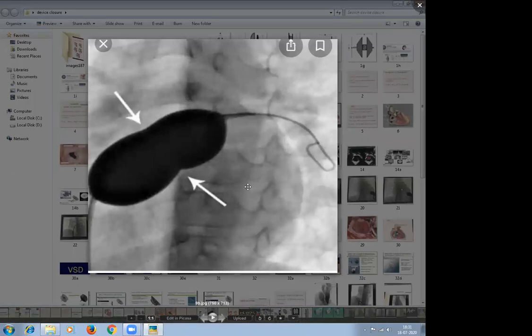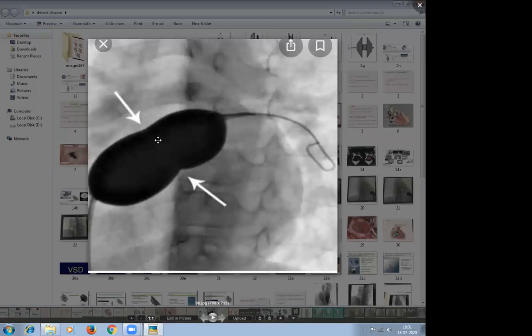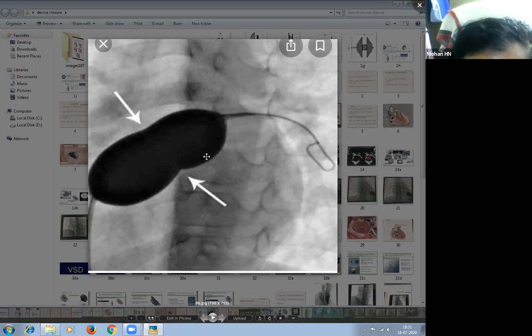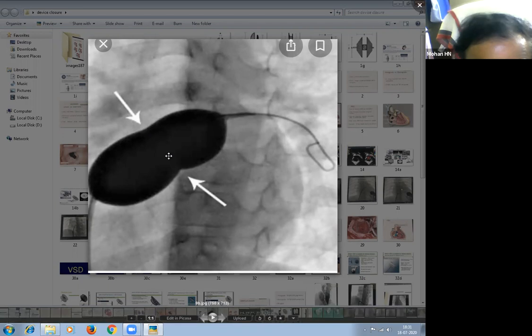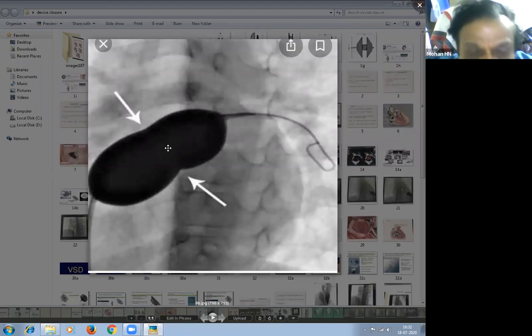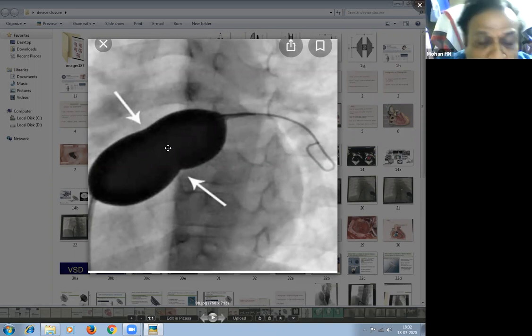How do we come to know the size, with which volume it slips out? In the static balloon or the occluding balloon? In both. See, here you can see, there is a waist. Can you see the neck here? This you will measure. Where will you measure it? This we will measure on the monitor. We have a computer, like a QCA, quantitative coronary analysis, and the vessel sizing option is there.